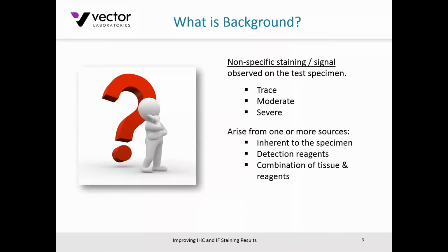However, things tend to compound when you start to see more moderate staining, maybe more widespread across different tissue types, and certainly when you get severe staining, almost like a blanket across your section, for example, or cell prep. If you are getting severe staining, there's probably something fundamentally wrong with that assay that needs to be addressed. More than likely, most investigators would encounter trace or moderate staining. But regardless, the background can arise from one or more sources. As I've indicated here, it could be inherent or endogenous to the particular specimen that you're working on. It could arise from the detection reagents, or indeed a combination of both the specimen and the reagents that you've chosen to use.